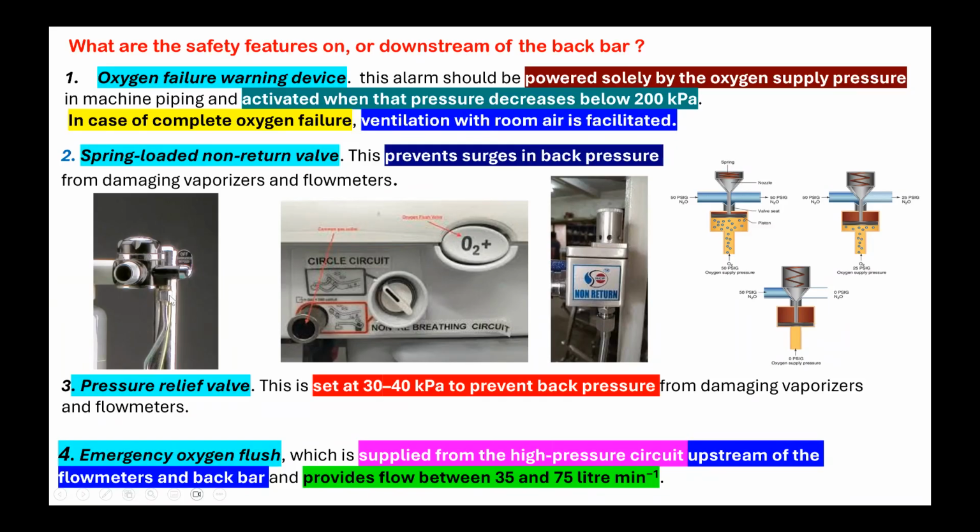Yes, sir. Okay. So this is how the oxygen is delivered and you have to flip this switch or the flap downward, and it indicates that if it is in the up position, it is off. So when you switch it down, it will show on position and gas will rush through this common gas outlet. And the common question the examiners ask you is, how many liters of oxygen will be delivered if you activate the oxygen flush?